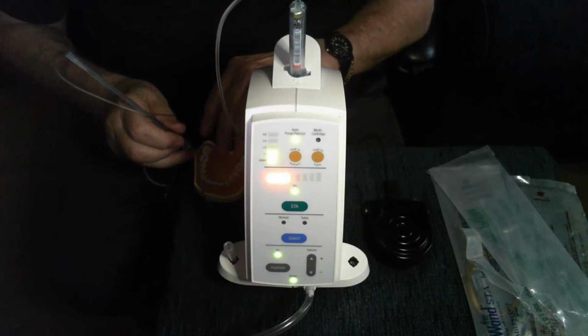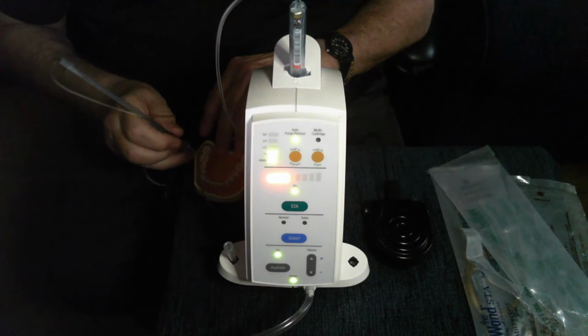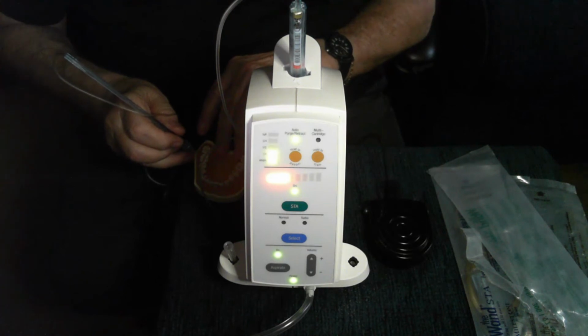These lights tell us that we're in the proper spot, like a GPS, but they will not tell you if you're using too much pressure on the needle. Sometimes people try to get the lights to go all the way to green. That's not what we want to do. We want to hold the needle in place with very, very little pressure.